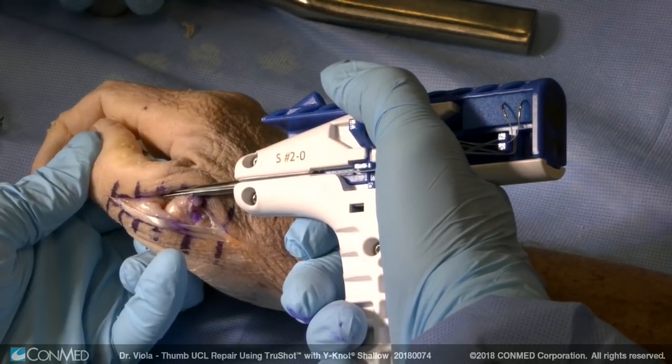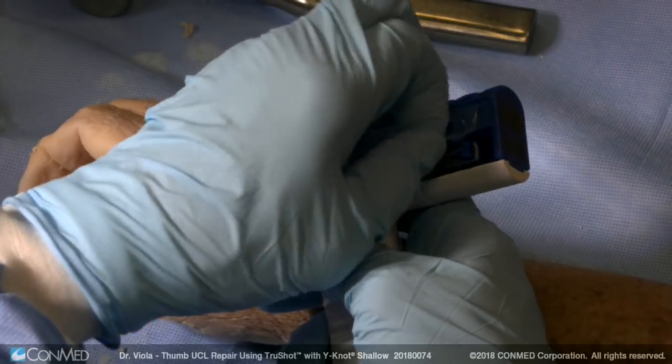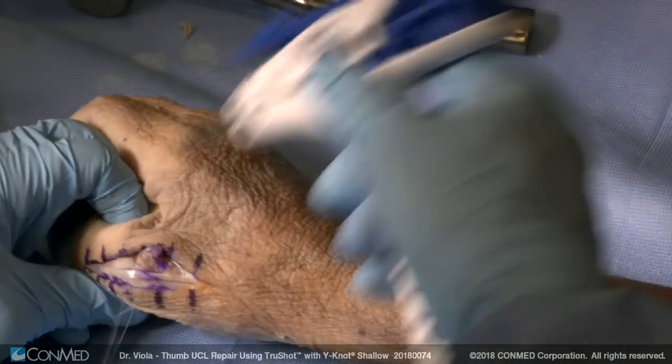The trigger on the device deploys the Y knot. That's it. Remove the sutures and remove the device.